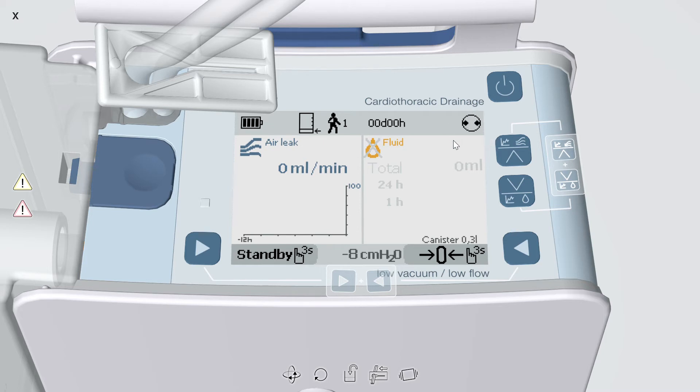You can see therapy is in progress with the rotating circle in the upper right corner of the display. On the home screen, the battery indicator is in the upper left corner. The left side of the screen shows the air leak and the right side shows the fluid output. The device defaults to show the total drainage, 24-hour drainage, and 1-hour drainage. To activate or reset a demand fluid counter, press and hold the bottom right arrow for three seconds — this can be reset at any time without affecting the other values.